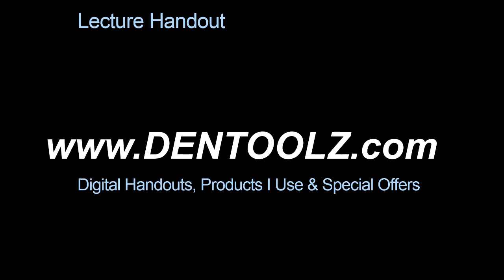Many of my Emax crowns, I'm using this because I see the benefit of it for long-term for the patient's health. And when I don't have good retention resistance for them, when I do need to have good adhesion, then I jump into my adhesives and my dual cure resin cements. So there's a time and place for everything. I think you need to have more than one product.